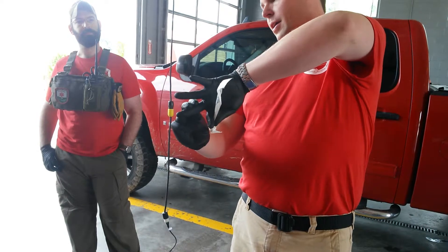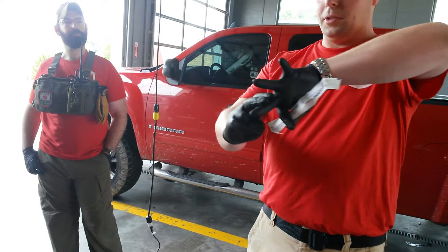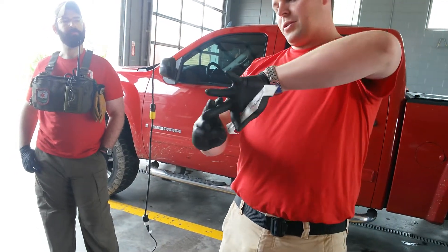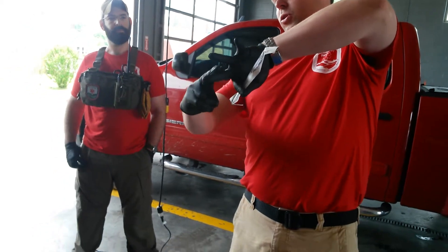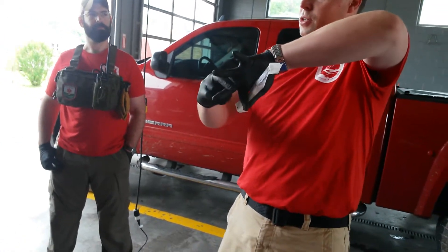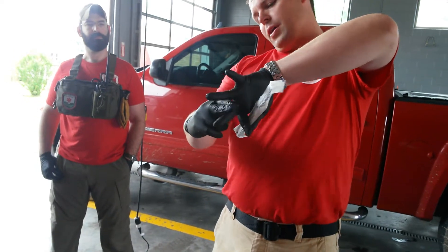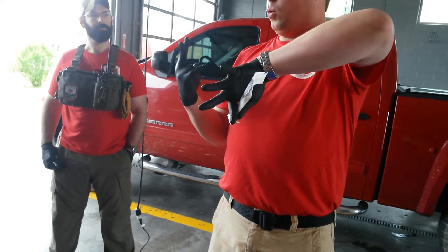Once you feel that — and this is where I said before, like, 'Sir, this is really going to hurt' — because if the guy's awake, this is really painful at this point. This part's actually not too bad; you can usually numb this up. What you physically do is shove the end of the clamp through that thing — you're literally just tearing a hole in the side of his chest. Then, when you've got it in there, you usually open the clamps up and pull them back a little bit to expand that hole.